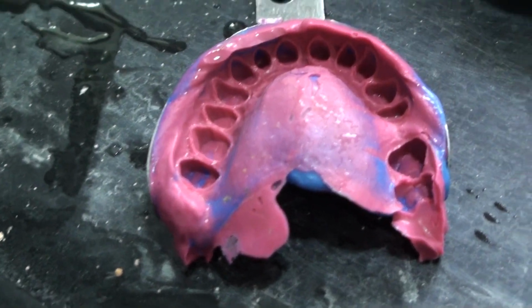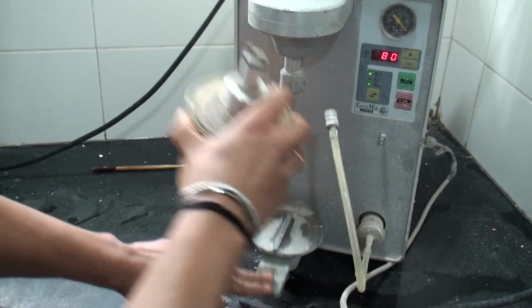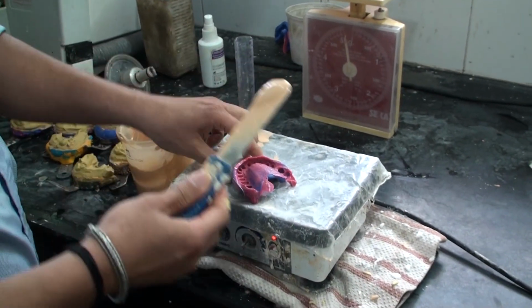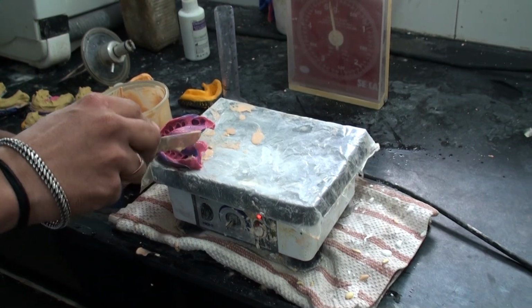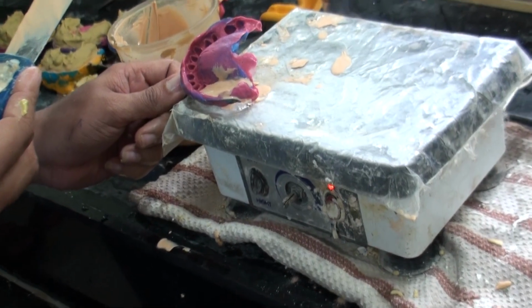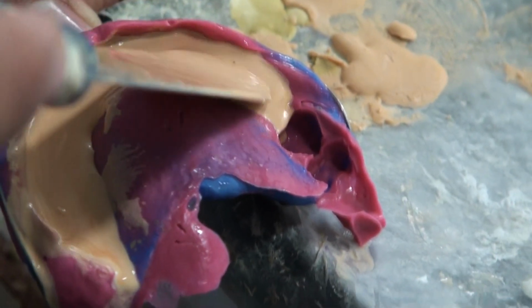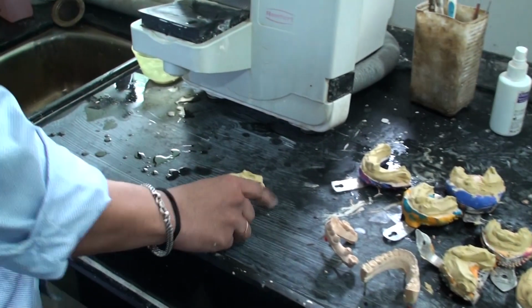And this is another impression where, as you can see, it's made of putty and wash, and he takes the mix out of the mixing machine and starts to pour it onto the impression. And he is using a platform that vibrates, so when he starts to pour the stone plaster, the platform vibrates and it eliminates any air bubbles. It's interesting the way he does it. He puts it on one side and then he allows it to flow to the other parts of the impression, and therefore that ensures that there are no air bubbles in your model.